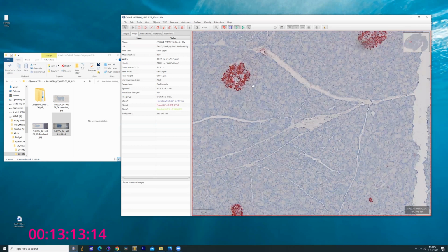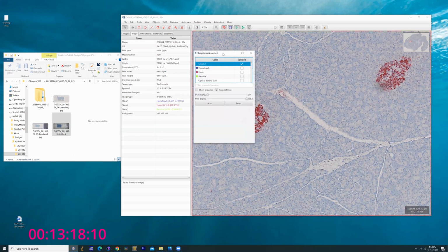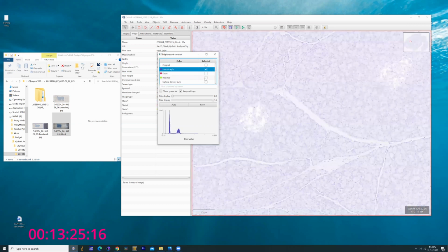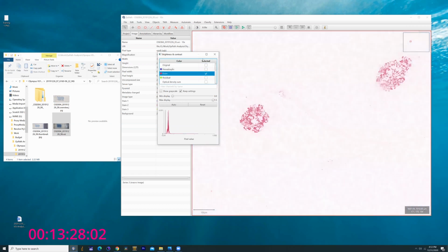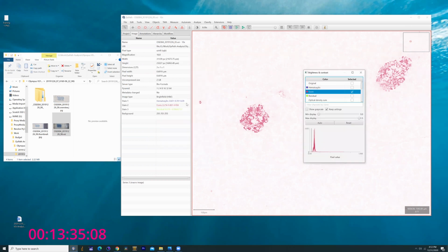If we were to zone in on these, we can look at this little button up here. This is the contrast, and it allows you to pick those channels that I was referencing using the numbers. You have the hematoxylin and the eosin, and these are the 2 we're going to focus on. We can modify these reference numbers in case there's a slight difference in color choice. There could be differences in intensity or slight shifts in color due to the acidity when things were stained. You can reestablish these reference numbers by clicking on them.